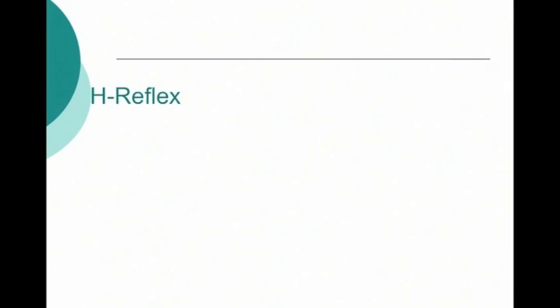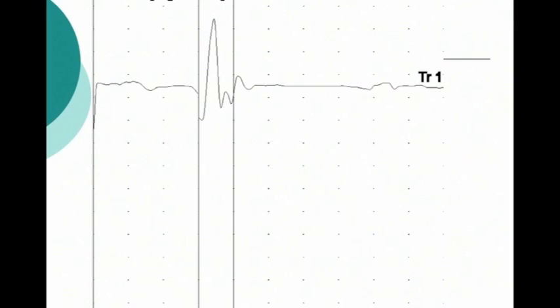How about the H reflex? This is a very nice H reflex. You can see that response very clearly. You can identify the takeoff, and you can position the cursor right there. Note very easily that there's either a small m or no m.